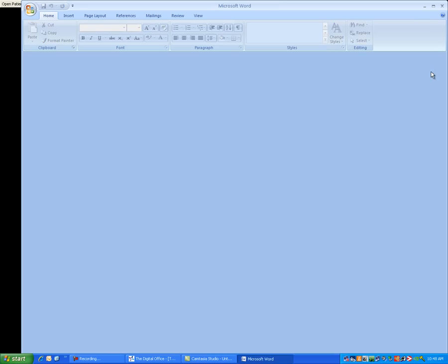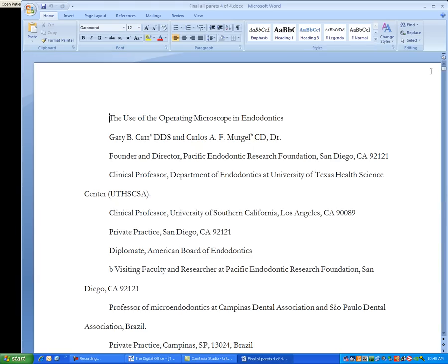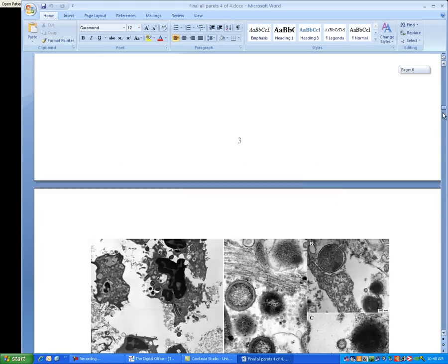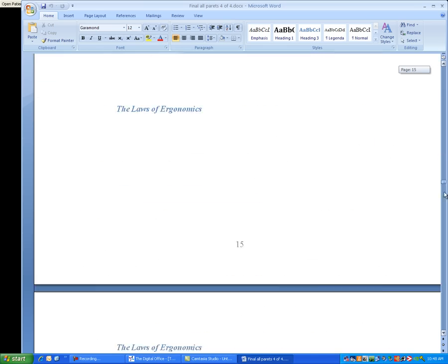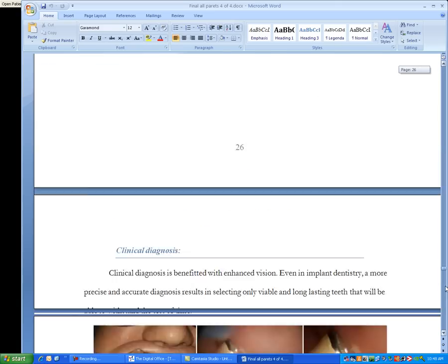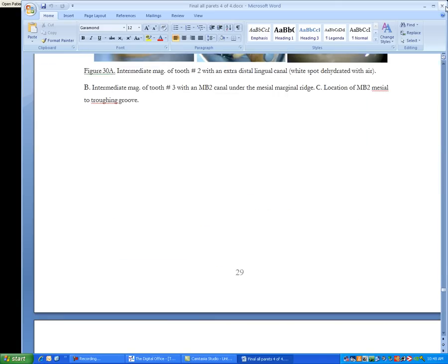Click my mouse to move to the next item. Now this is opening up a Microsoft Word document. This was a chapter written by Dr. Carr and Dr. Mergell. Close Microsoft Word.